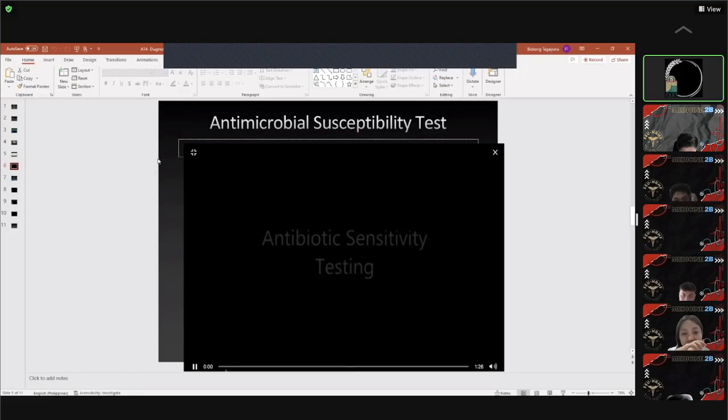So if you're able to identify an organism by doing culture and by using differential tests, meaning tests that would eliminate one group of bacteria to another, and also using differential media, a very differential medium that allows you to differentiate the bacteria if it can grow, if it cannot grow, if it's inhibited. It's basically by elimination. There's actually an automation on that.